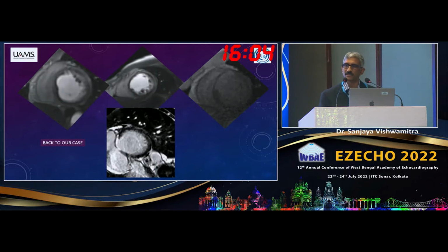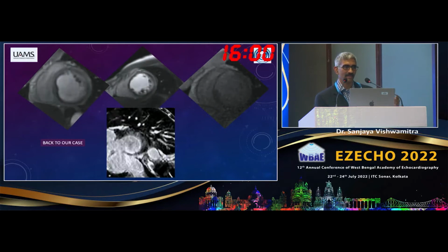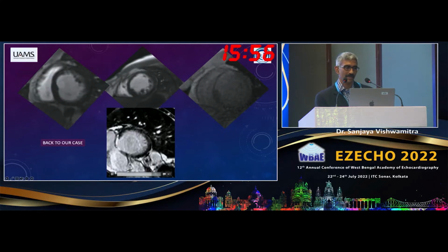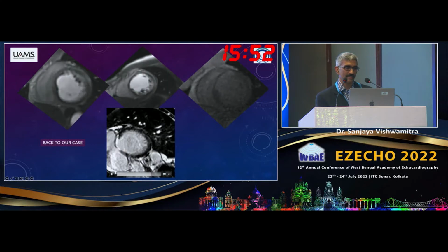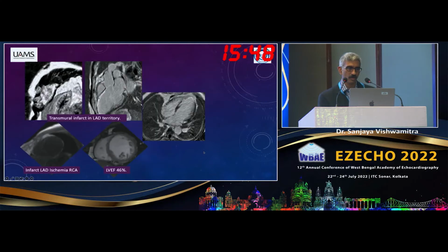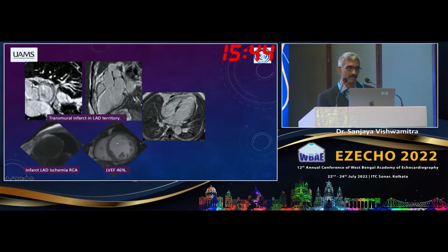which typically means for us that there is very little myocardium left which can recover after revascularization, and we tend to describe this as a non-viable area of myocardium. And you can also see that, in contrast, there really is no delayed enhancement in the inferior wall. These are just the other images showing you the overall picture.